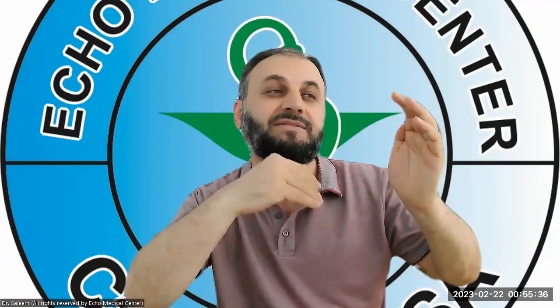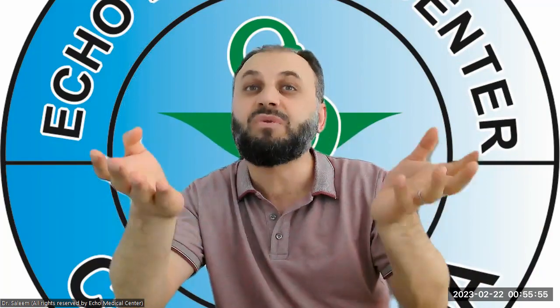So take a gray image and try your best to get the whole bulbous area, the bifurcation area, to see the ECA and ICA, and also a little bit of the distal CCA. And then put the color box on and try your best to cover the distal portion of the CCA itself, the bulbous, and a little bit of both the ECA and ICA. So cover everything. Here, take gray and color, but I don't take the pulse wave Doppler in this area. If any of the doctors or healthcare providers take it, they may have a reason for that. I don't take it.